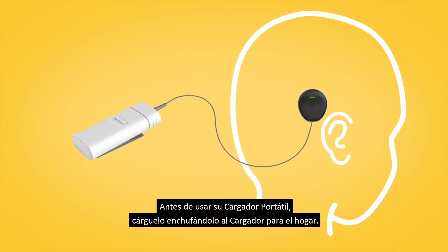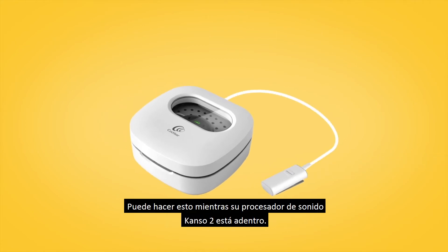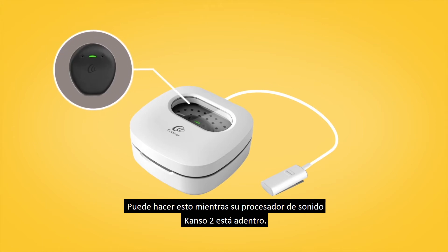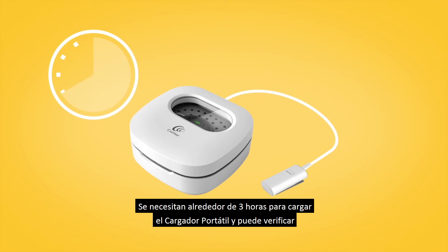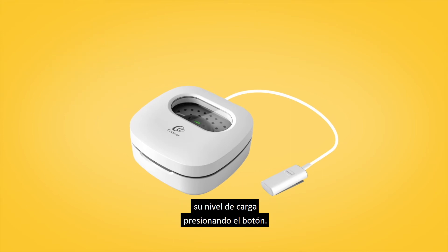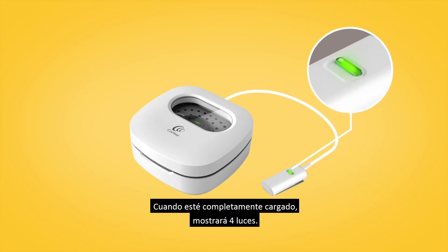Before using your portable charger, charge it by plugging it into the home charger. You can do this while your Kanzo 2 Sound Processor is inside. It takes around three hours to charge the portable charger, and you can check its charge level by pressing the button. When fully charged, four lights will display.